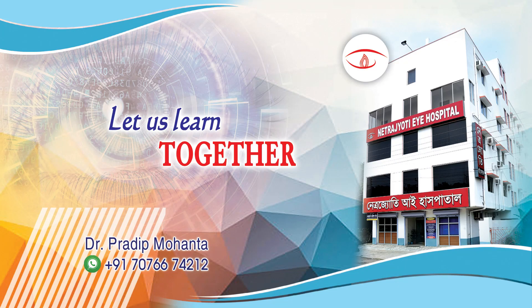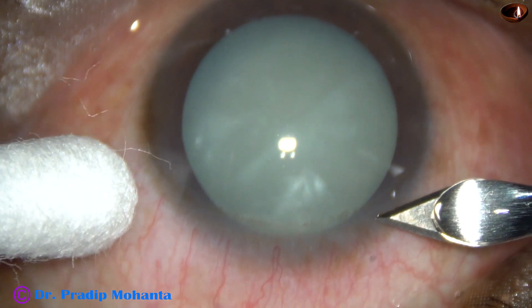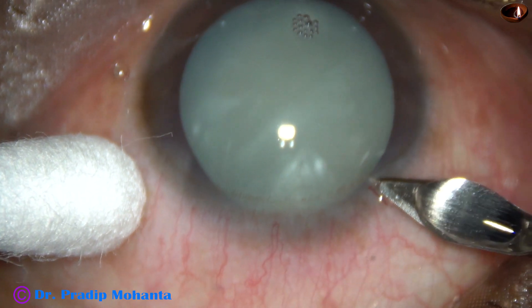Friends, welcome to my workplace at Ranaghat, West Bengal, India. This cataract is not only intumescent, its nucleus is very soft. Let us observe this surgery.